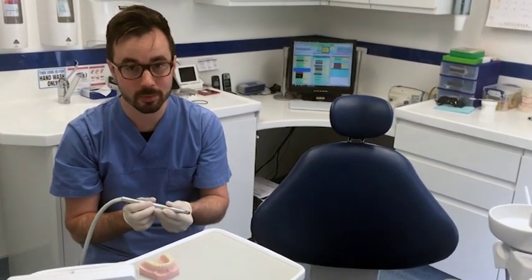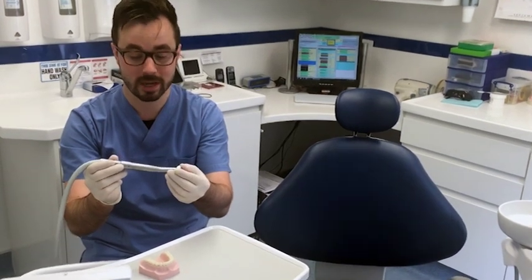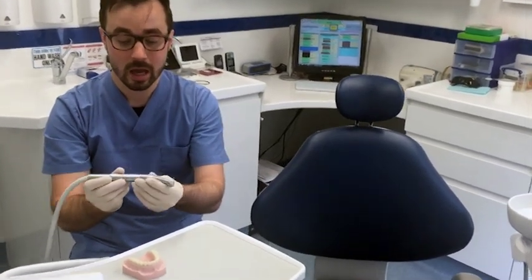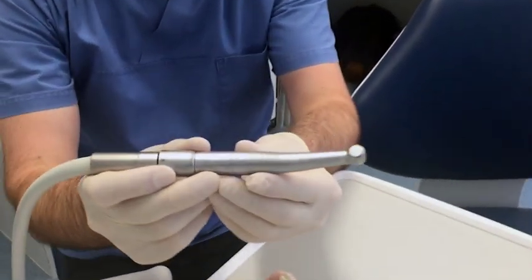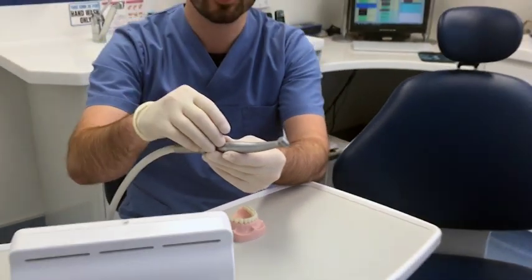At St Stephen's Dental Practice, we are very modern and we have incredibly modern dental handpieces. Just a quick close-up of the actual drill — it's brilliant.